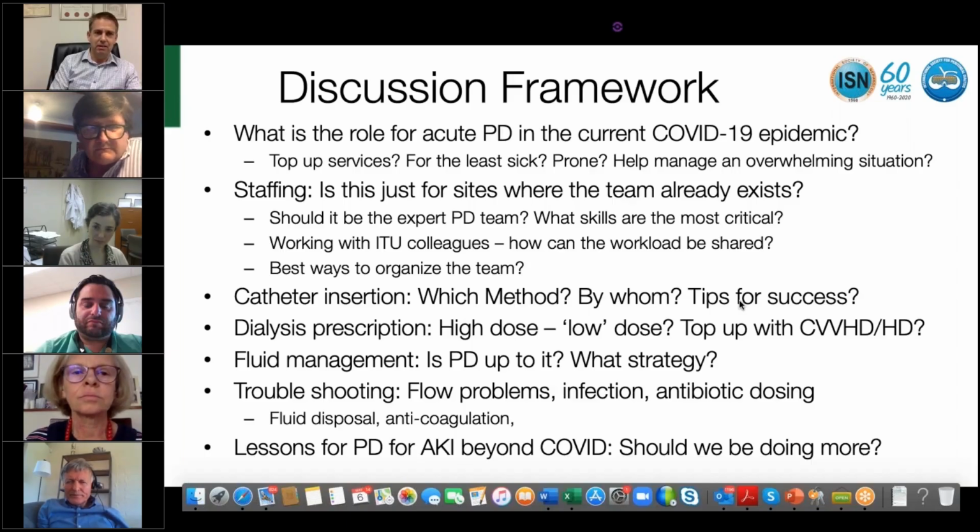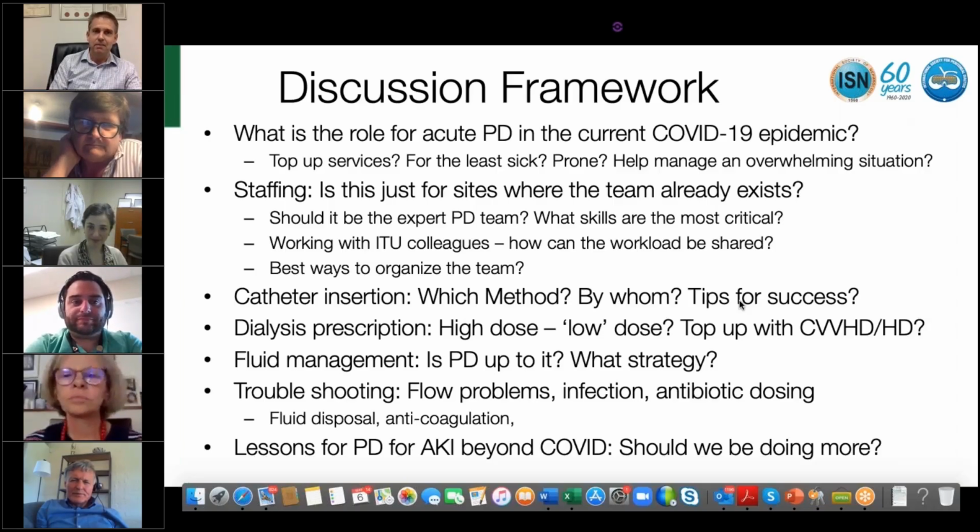it does the thing about acute PD that I always find surprising. I don't know whether the other groups have found this. You're almost surprised at how well it works. You do it and you think, is it really going to work? And then it works so well. You're very surprised by it because we think that it's not a good form of treatment. But if you look at all of those studies that Edwina showed you earlier, those studies from Brazil and Saudi Arabia, and from Thailand, all have very sick patients. 70% of patients were ventilated. So in the ill patients, I think it works very well.